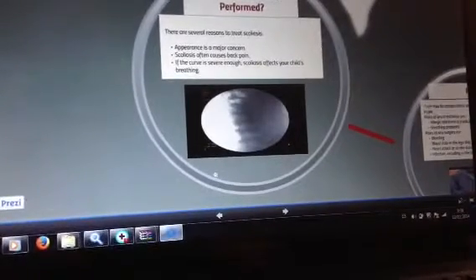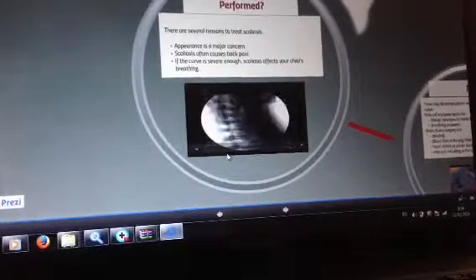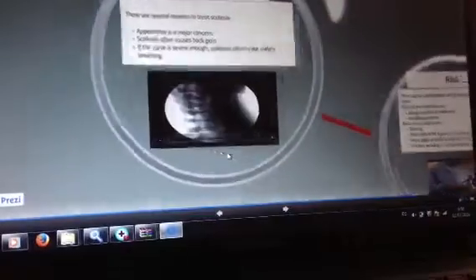Bony margin around the screw. Here we check with fluoroscopy, after I've placed the screws in a freehand technique.